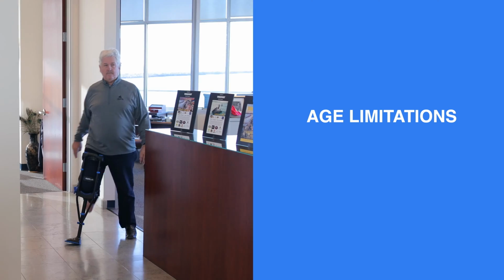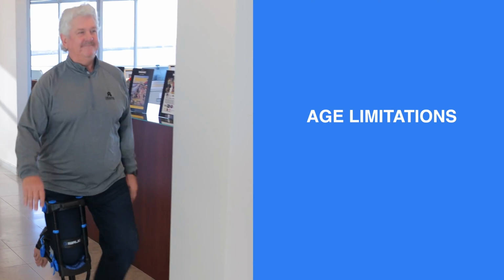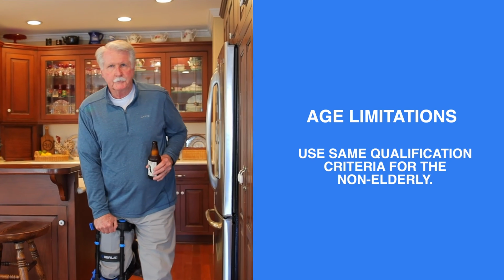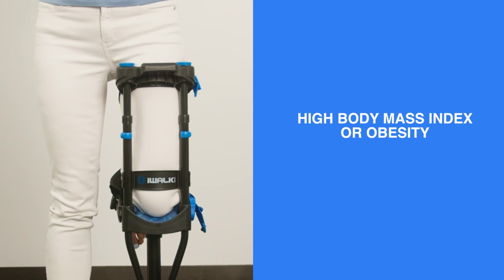Age limits. Using age as a qualification criteria is way too broad. The mobility of seniors varies significantly from person to person. So with the elderly, use the exact same qualification criteria you use for the non-elderly.